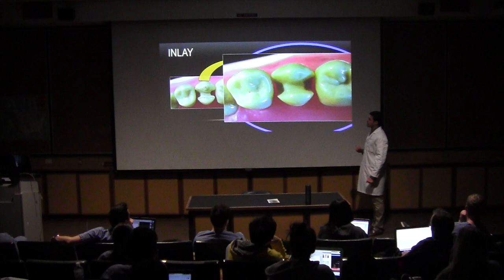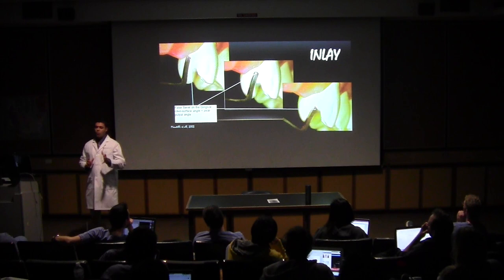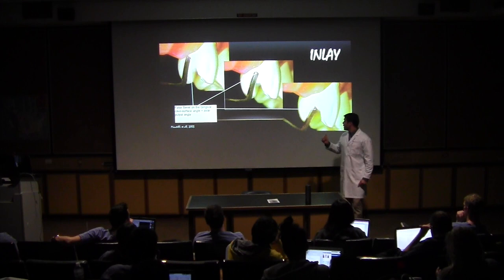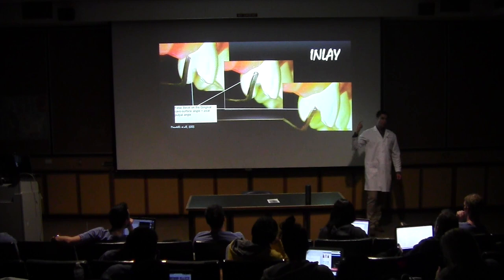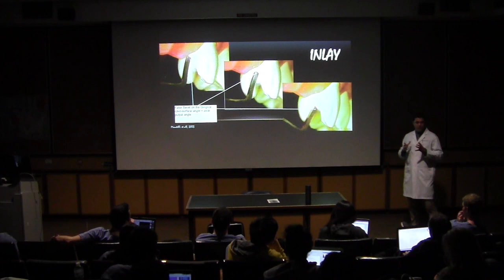But the prep is not finished yet. After that, we must work with the manual instruments. And not only in class 2, you are going to work with the gingival marginal trimmer. Also here, we must use the gingival marginal trimmer to remove the unsupported enamel. It's with these steps that we are going to achieve a prep like we saw in the beginning of the lecture, with all the margin with that beautiful enamel, right?